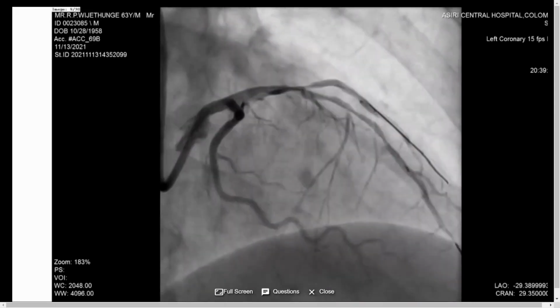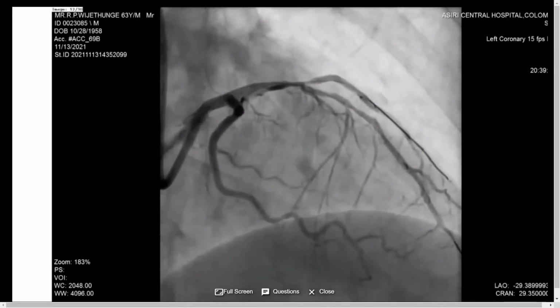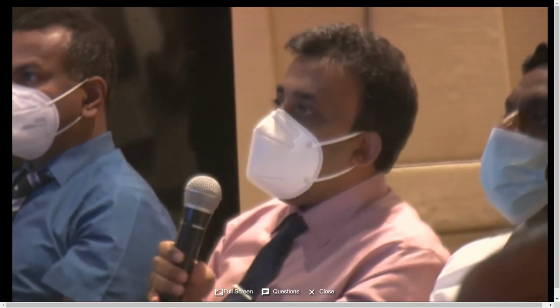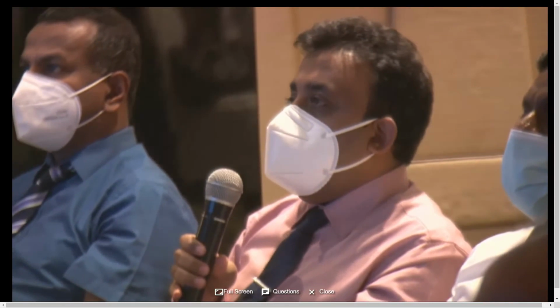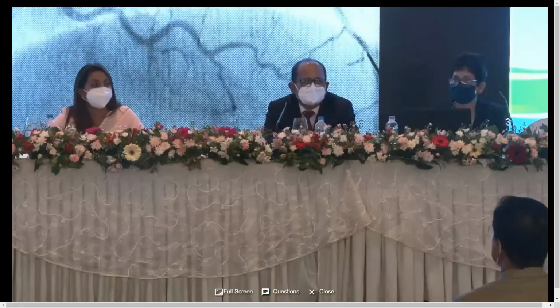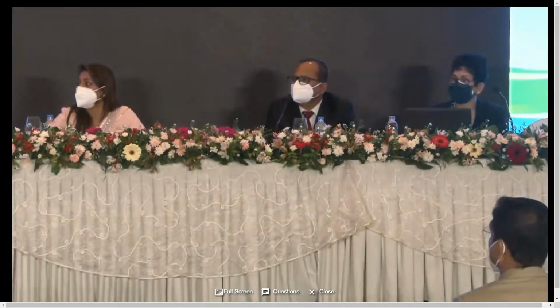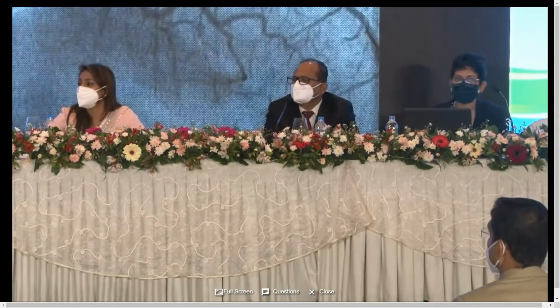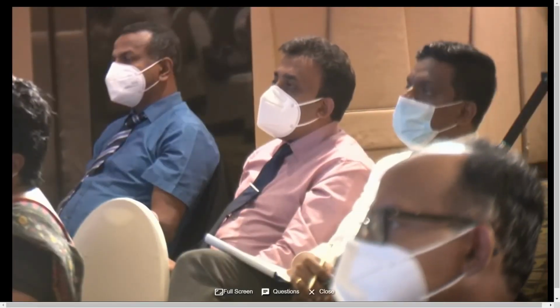We have limited views, I think. We can see left main engaged, there's a catheter going downward. Then LAD and D1, with an angle less than 70, and a diagonal 90% ostial lesion. Actually it's a 1-1-1 lesion involving the main vessel, the side branch as well as the distal vessel. So it is a true bifurcation lesion.